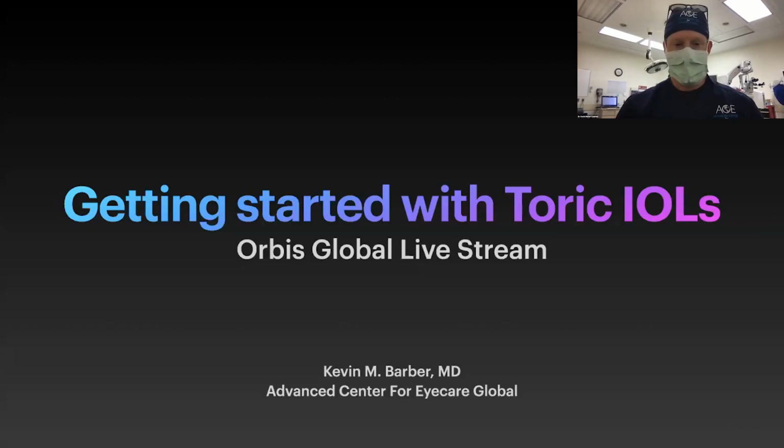All right, so I'm going to go ahead and share my screen here, and I've prepared just a kind of 10-minute talk here about toric lenses. So we're going to transition from the MIGS procedure. We will be able to answer some questions at the end of the morning on that. I wanted to just give you guys some pearls about toric lenses.